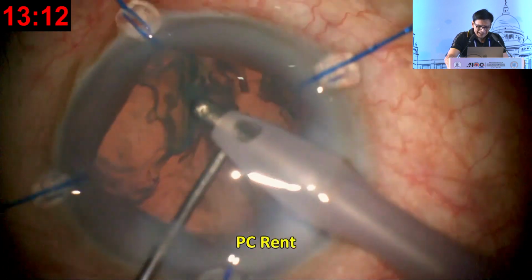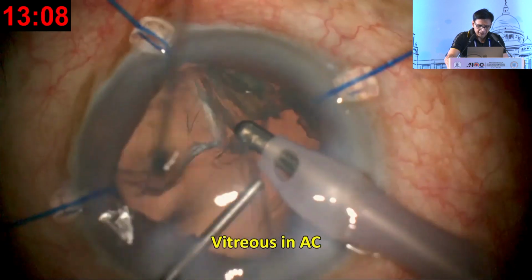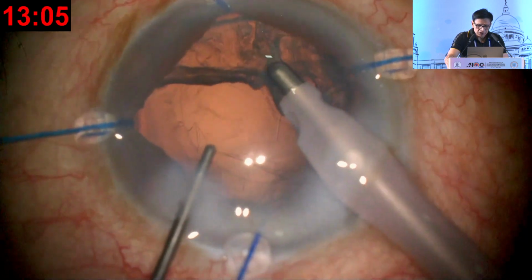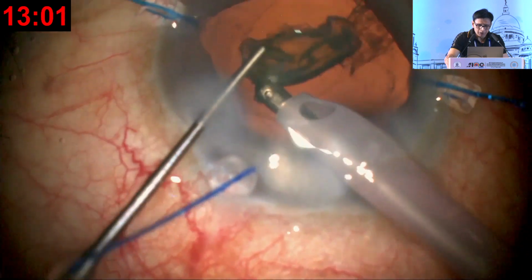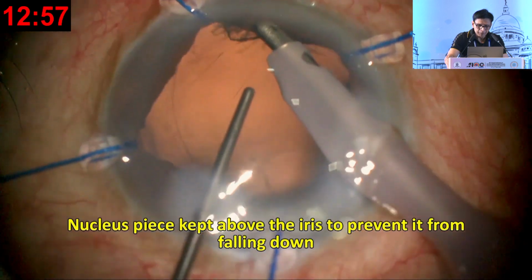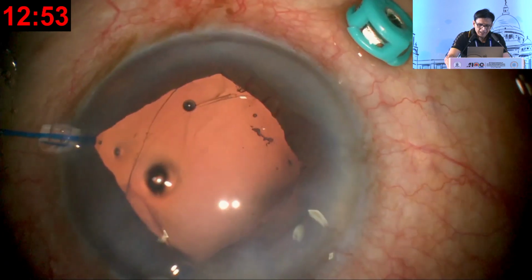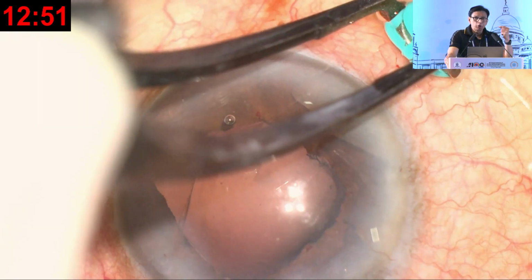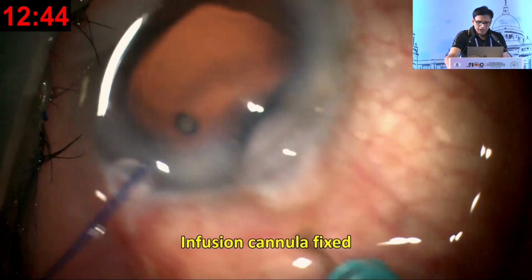And at that stage, I noticed that rent which the trocar had created, and you can see vitreous is in the anterior chamber. Now there's a nucleus piece also lying there. So what I'm doing is I've taken that nucleus piece and I've kept it above the iris. I can't remove it because now at this stage, if I try to remove my nucleus fragment, it will drop down. So I now take off my iris hooks. I've shifted that same trocar to infusion.